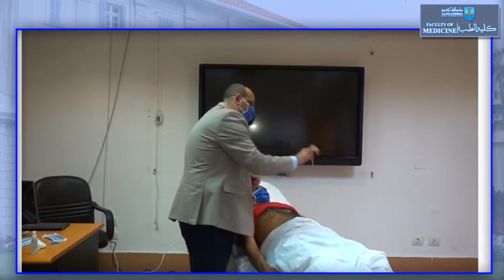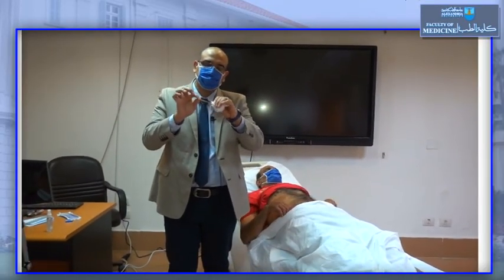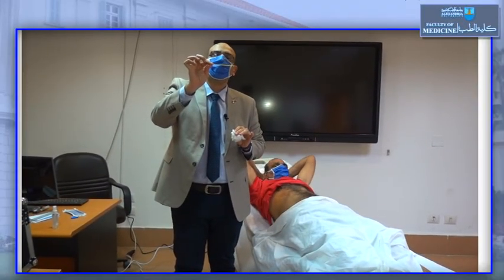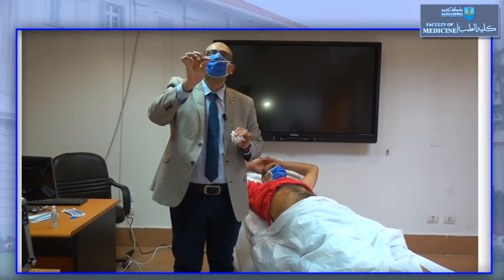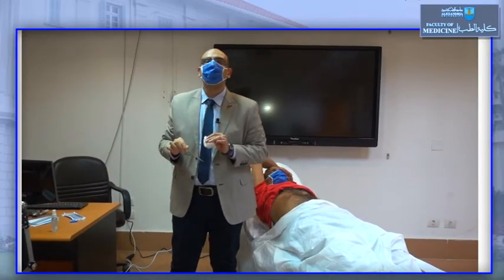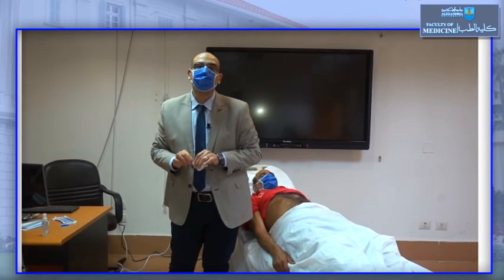Now we remove the thermometer. After we remove the thermometer, we should wipe it with the cotton. And we rotate it until we see the mercury. It is here at 36, and then we add 0.5 degree because we measured it in the axilla. So the patient's reading for temperature is 36.5.